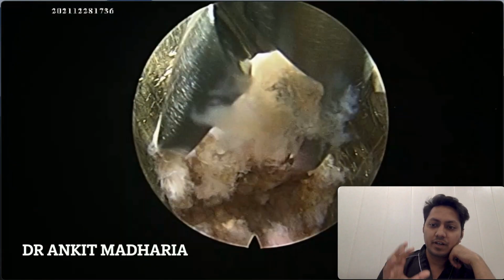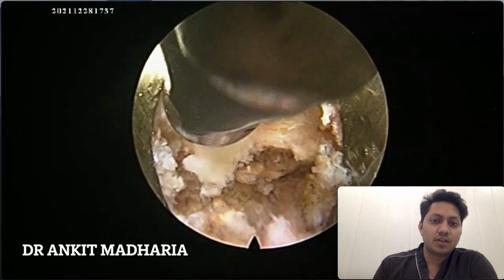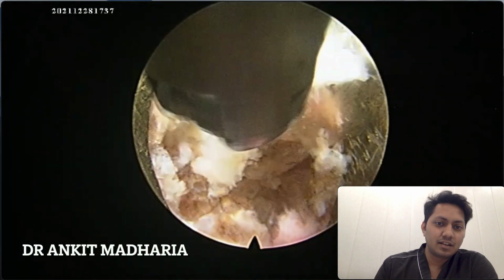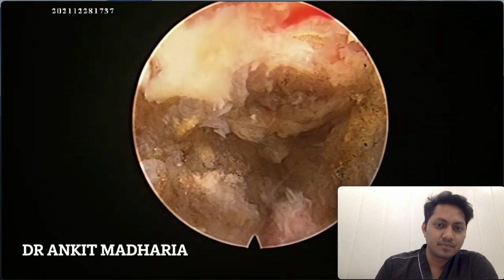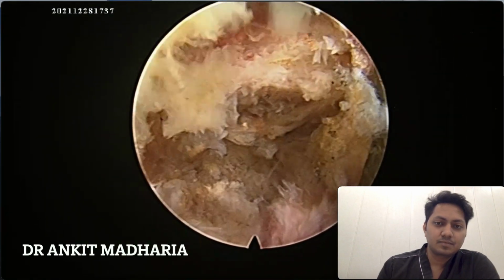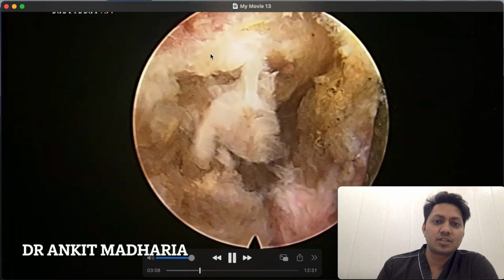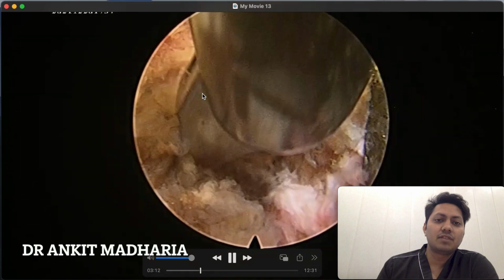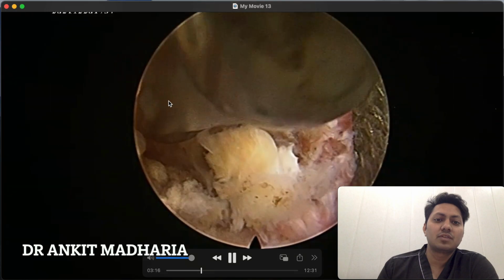These curettes are quite sharp, and without using a burr or high speed instruments, we can easily cut the undersurface of the facet with these curettes. Now you can see this is the facet joint, the bony structure, and I'm just releasing the undersurface of the ligamentum flavum, and you can see the bone is very well cut here with just our curettes.